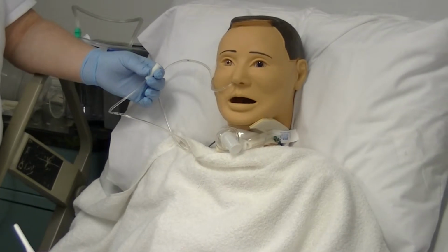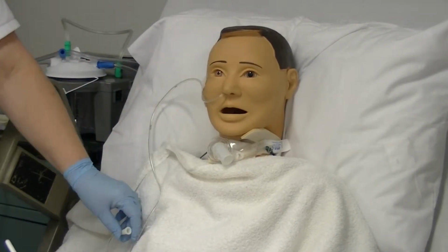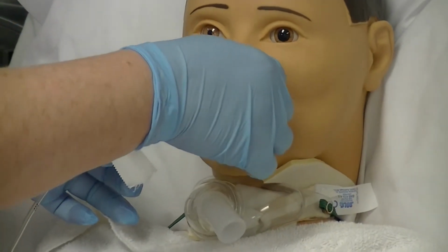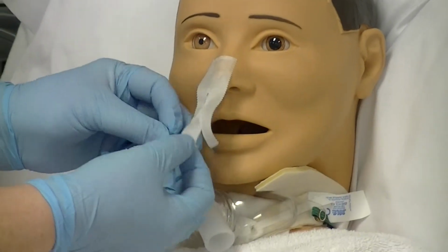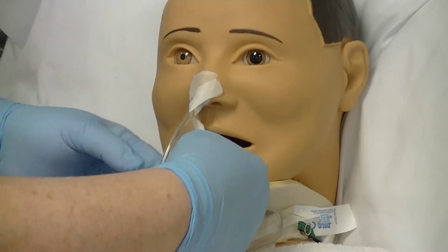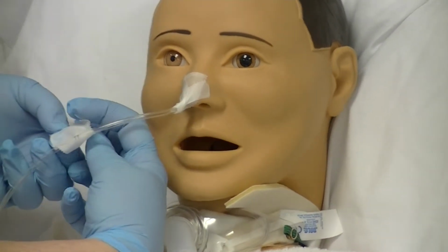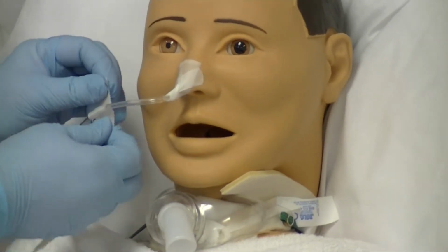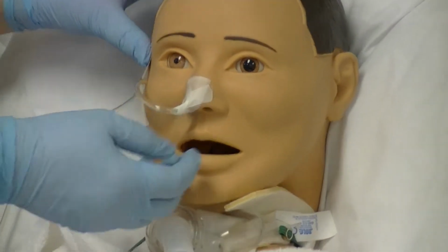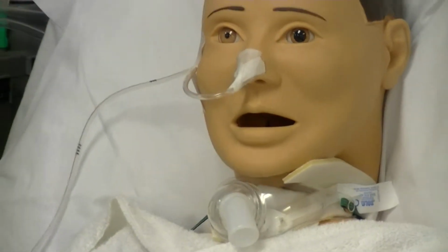For this purpose, we've had our x-ray, placement's good. Then we're going to anchor the tube to the client's nose and to the cheek. Attach the feeding per physician's orders.